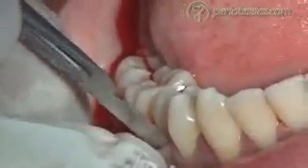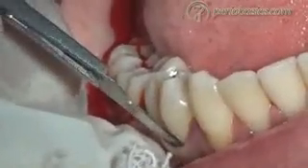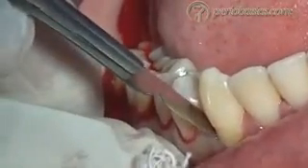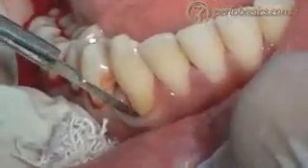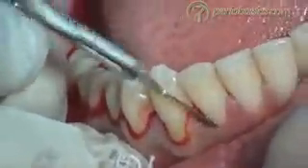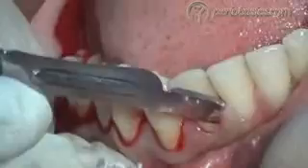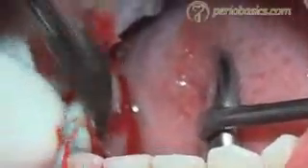As you can see, I am putting the incision from the sulcus till the alveolar bone. You have to make sure that the incision is placed right into the sulcus without cutting the flap. So this is how we complete the incision. And in the same way the incision is given on the lingual aspect.